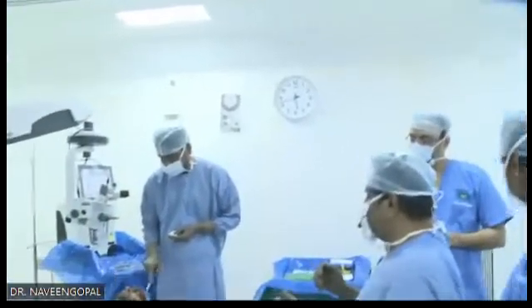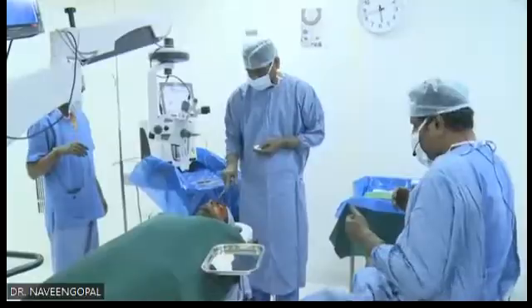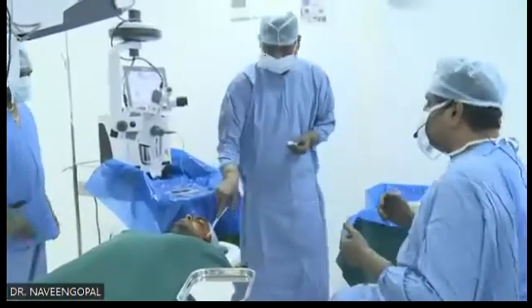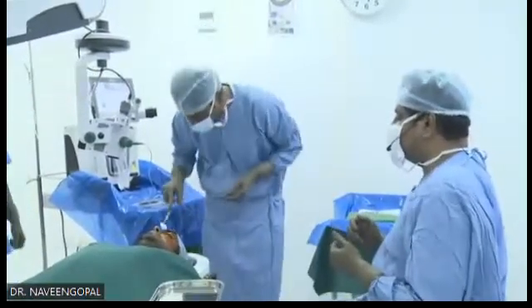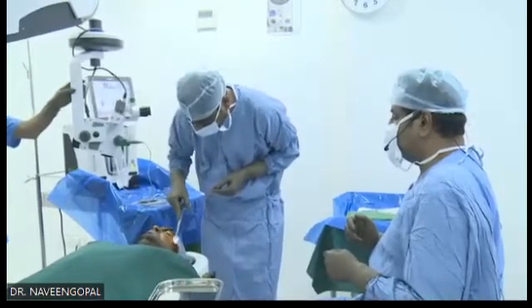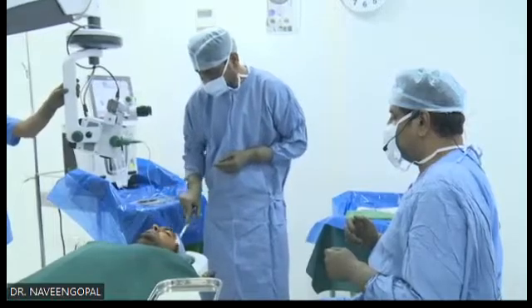A few of the parameters required for any phakic IOL calculation would be the K1, K2, the corneal thickness, anterior chamber depth, white to white, axial length, and of course both types of refraction, that is manifest refraction and the dilated refraction.